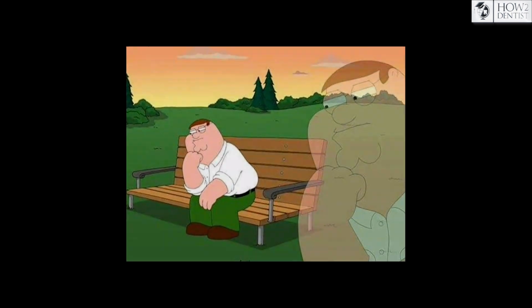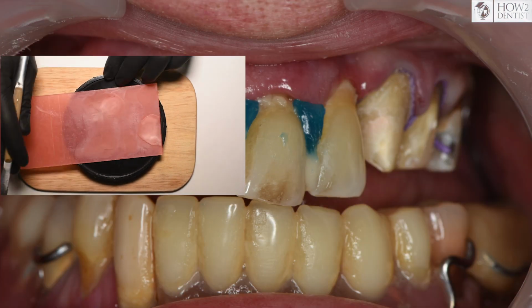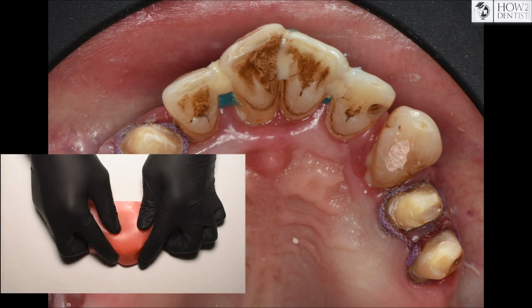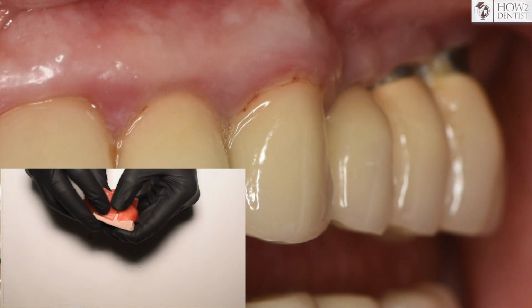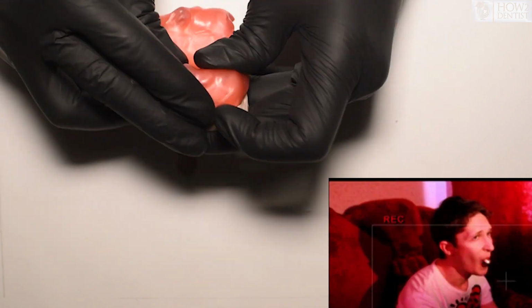Now you need to choose the number of wax plates. As a rule, there are 2 plates of 1.5 mm base wax, but if the remaining teeth have significant anatomy, periodontal atrophy, or the mouth has existing bridges or crowns on implants, then the number of plates is increased to 3-4. This will avoid an awkward situation when a custom tray is stuck, and it's extremely difficult to remove it.